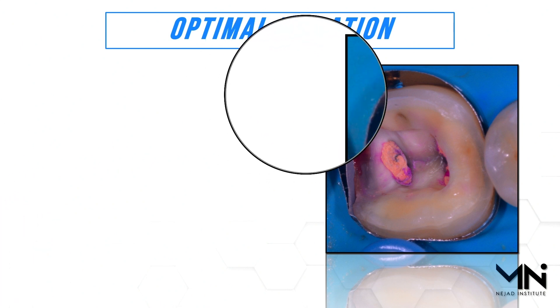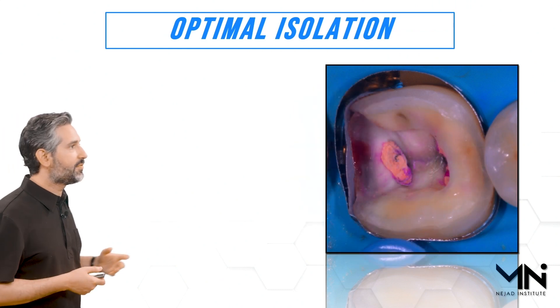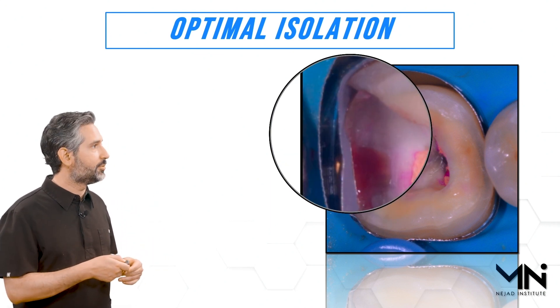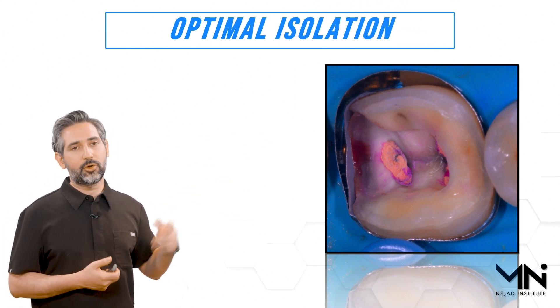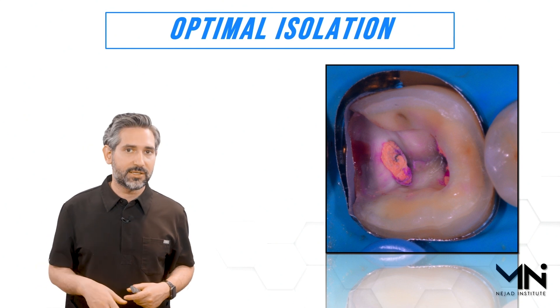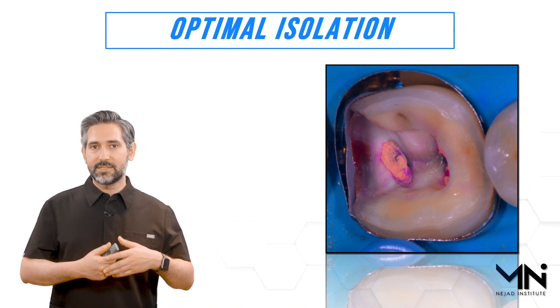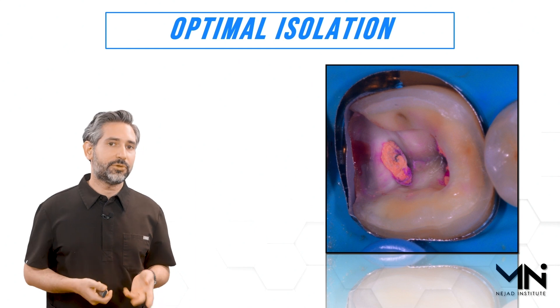Optimal isolation is imperative to get this technique done. Sometimes I use something called a matrix within a matrix — you can see we have the Real Matrix band and then a separate sectional matrix band between it. I haven't finished tightening so I still have a little room to tighten and pull things in tighter. If you cannot keep it dry while doing the procedure you'll run into problems, but if you can get good isolation you can get really strong bond and really good results. Nowadays I'm using a stiff matrix band in place of that standard sectional band.